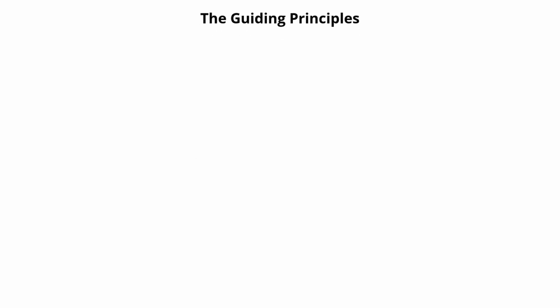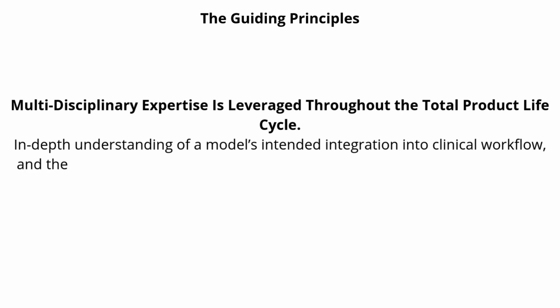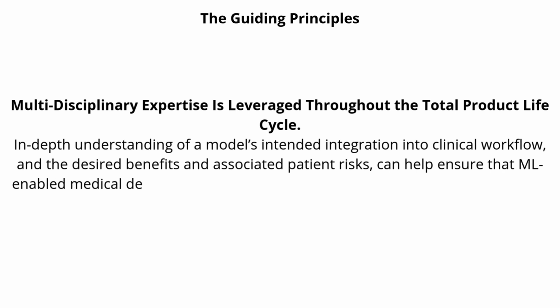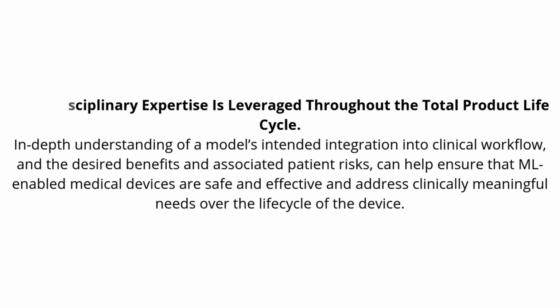The guiding principles. Multidisciplinary expertise is leveraged throughout the total product lifecycle. In-depth understanding of a model's intended integration into clinical workflow, and the desired benefits and associated patient risks, can help ensure that ML-enabled medical devices are safe and effective and address clinically meaningful needs over the lifecycle of the device.